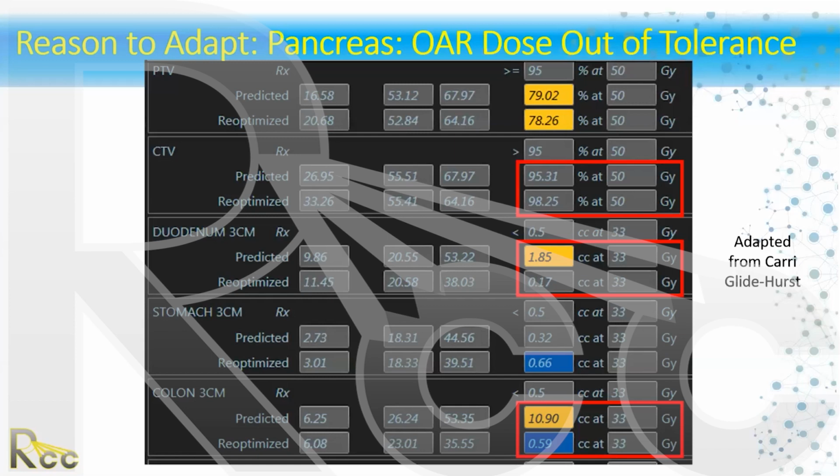Now, other sites, like if you're doing conventional lung cases with MR guidance, then you will see some changes in a conventional way over 2 to 3 weeks. But generally with SBRT, you're not seeing a lot of change in the 5-fraction regimen, right? Because it's usually a week or a week and a half. So we don't make changes in SBRT typically for targets.